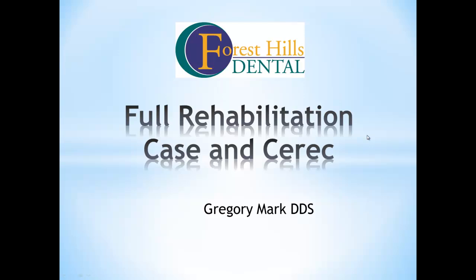Today I would like to share with you the case I finished yesterday. It's a full rehabilitation case in Cerec.